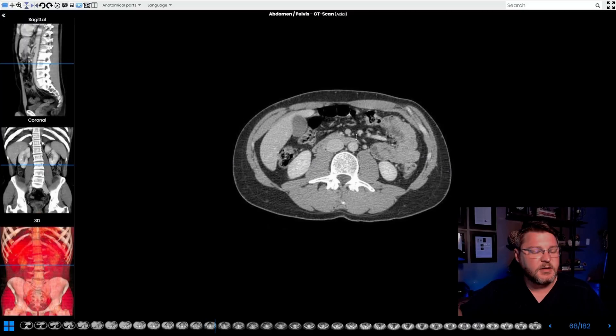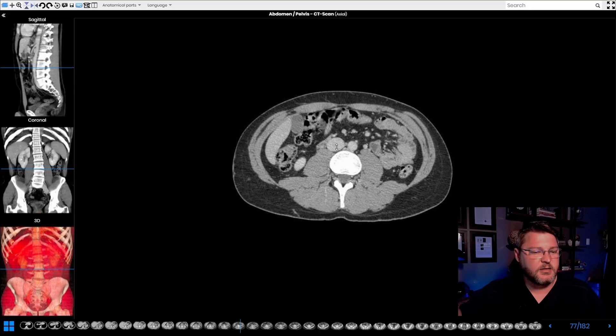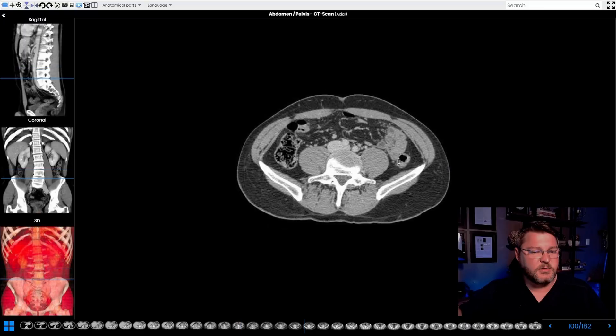Right here you see the descending aorta and the vena cava. This is the ascending colon, and the descending colon is starting right about there.